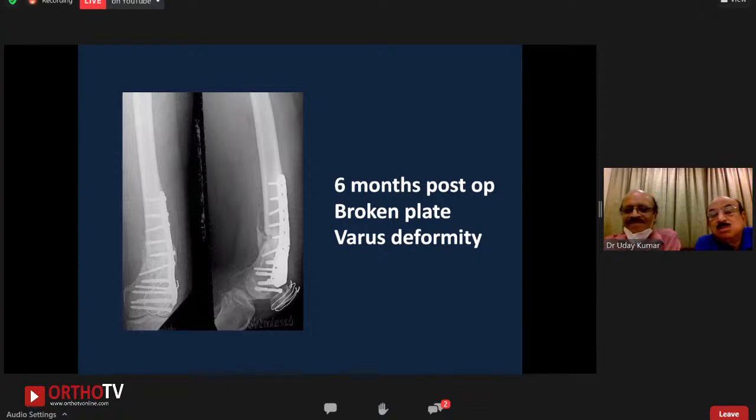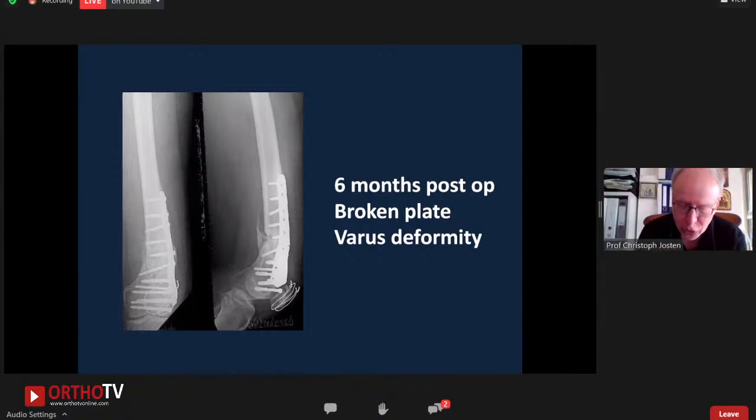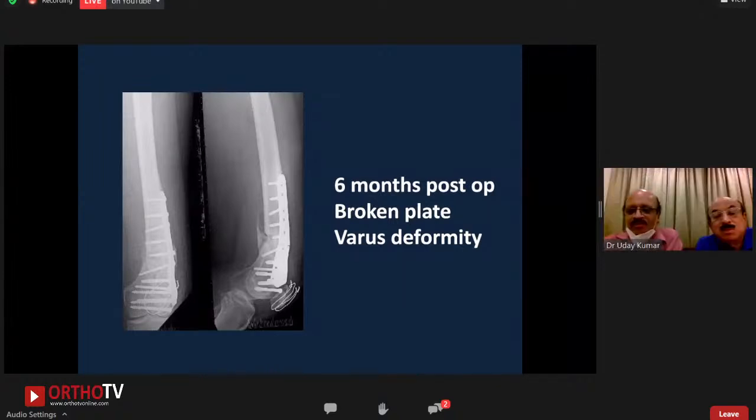Yes, Professor Justin. So it has occurred as I predicted, but why did you wait 2 additional months after you saw after 4 months that there is a break of the plate? Is there a reason that you waited? Did you hope there would be secondary healing? My question to you. No, as you said, maybe by May, some callus was forming here medially. So probably we waited a little longer, that's all. Probably today you will not wait another 2 months for the plate to break. Rather, we were sitting and praying for it to heal.